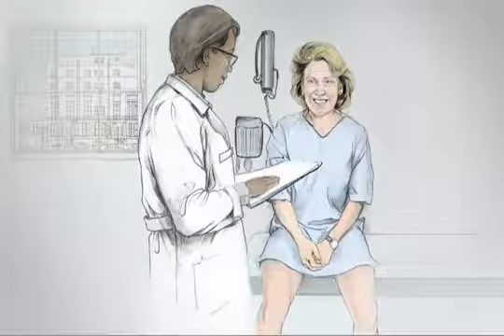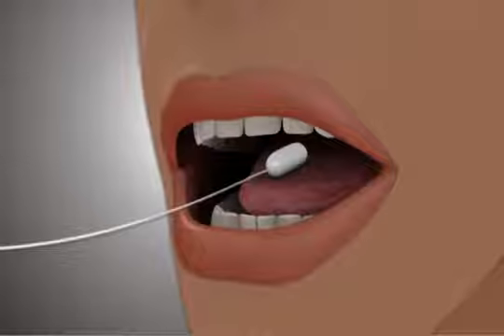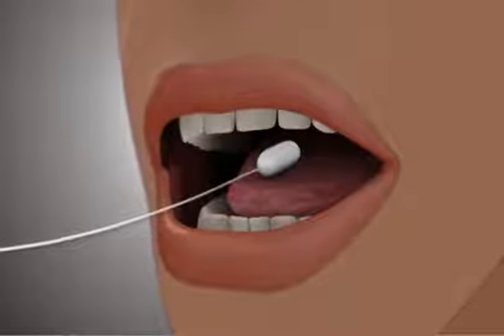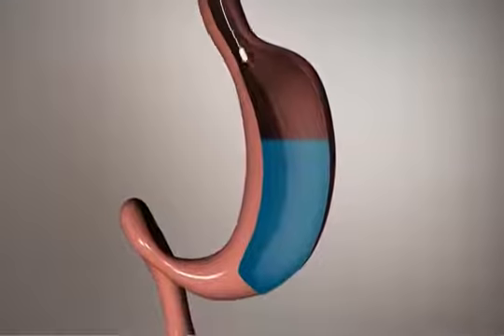The Ellipse is a weight loss device that can be swallowed in a doctor's office without endoscopy or anaesthesia. The Ellipse is packaged into a capsule and attached to a thin, swallowable delivery catheter. The catheter is long enough so that once the capsule is swallowed, the balloon can be filled from outside the mouth.